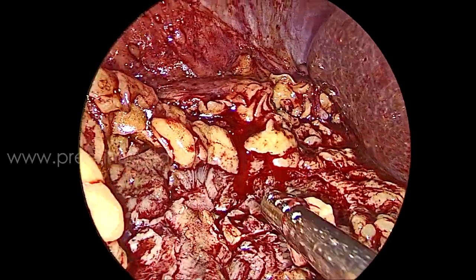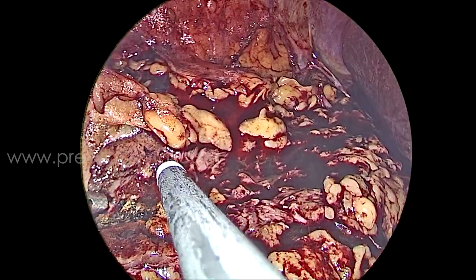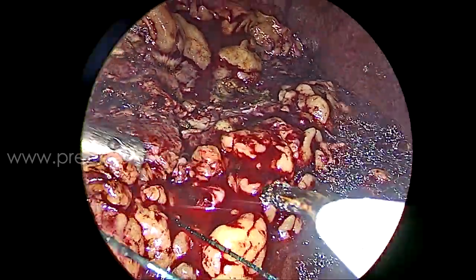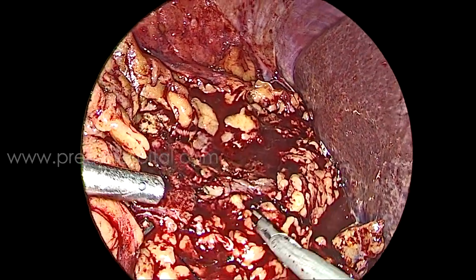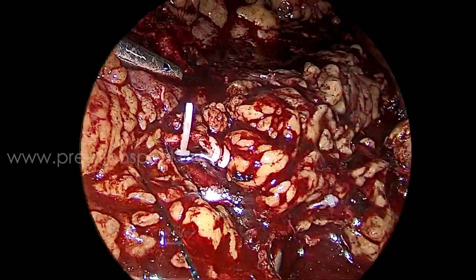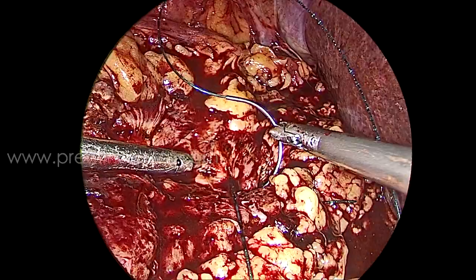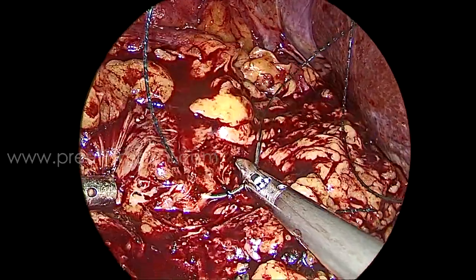This is exactly what we wanted to show. For suturing the inner medulla, some people coagulate. See such a large artery at the hilar region — this type of vessel may come, one should be very careful in the mid part of tumors. That vessel was clamped — it was going to the tumor. Standard V-lock 2-0 is used, and slowly the corticomedullary region and deep part are sutured.